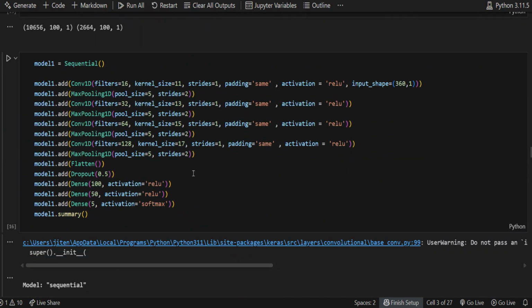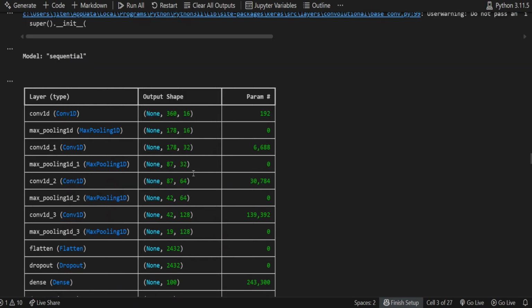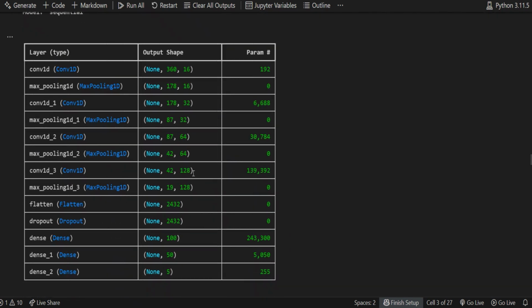Then we use sequential layers. What are the sequential layers and how will we use them? There we basically use a convolutional layer, max pooling layer, dense layer and dropout layer. So let's talk about the layers one by one. What layers are used, and why?